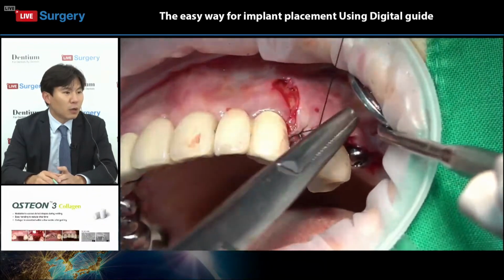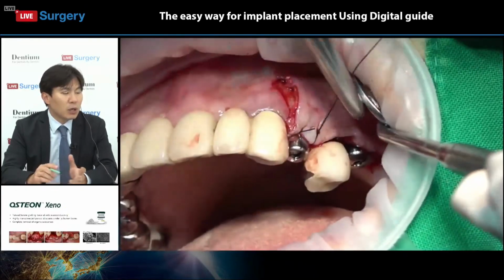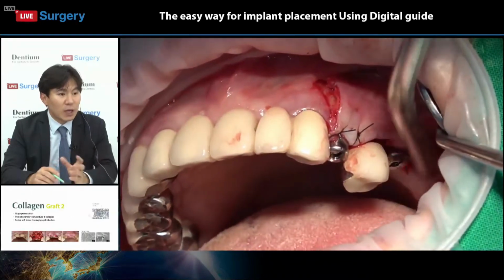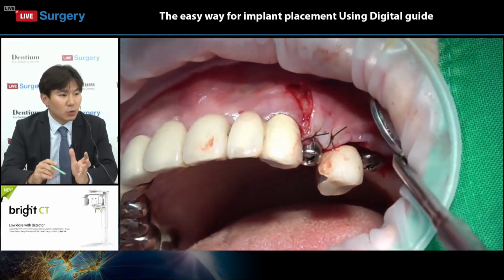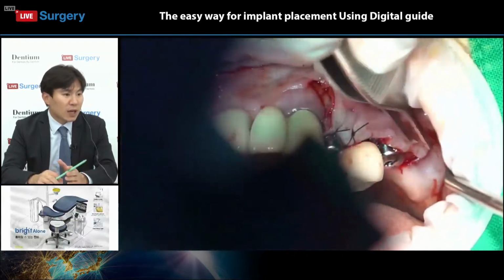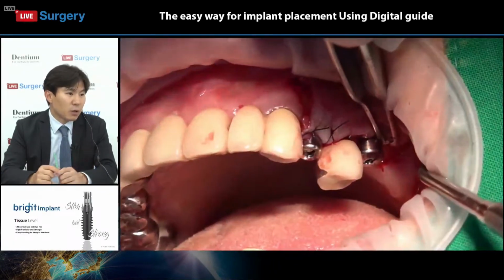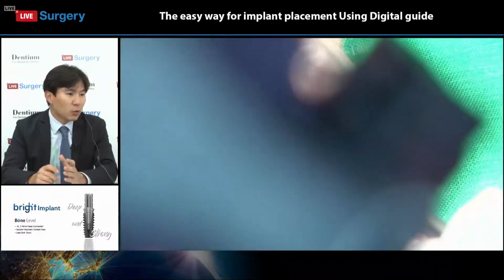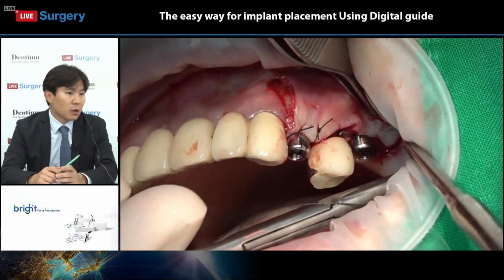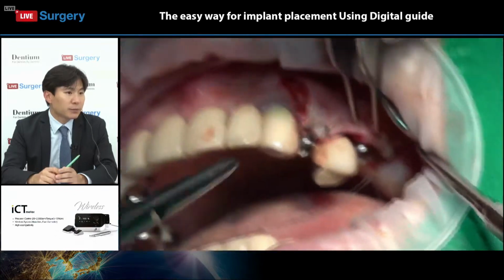And for this surgery, he only did bone augmentation surgery in the 24 area, not the 26 area. So the main part of the surgical site is the medial side. So for this kind of surgery, it's wise to start making sutures from the medial area.